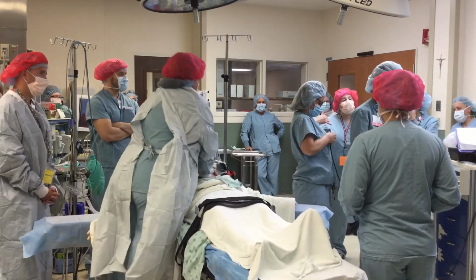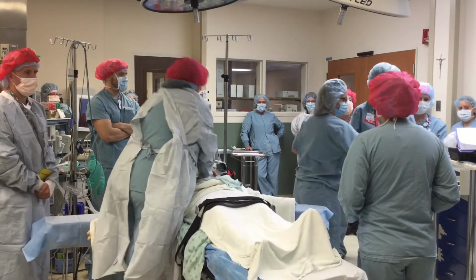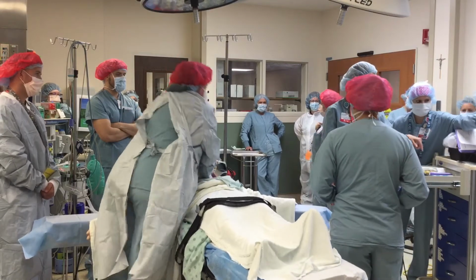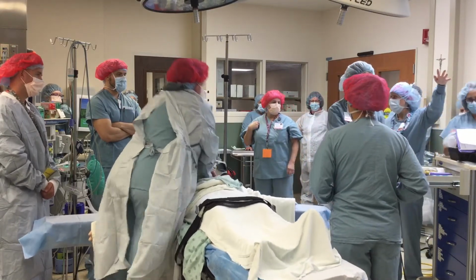Rachel, have you called the unit to find out if we can get a critical care bed, or do you want me to do that? Alright, I'm charging. Sure. Okay, I'll do that first. Epi in please.